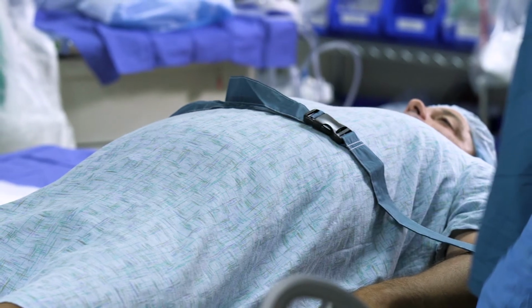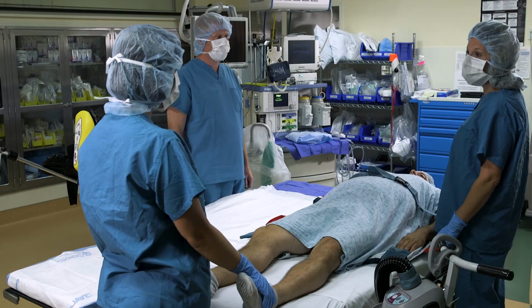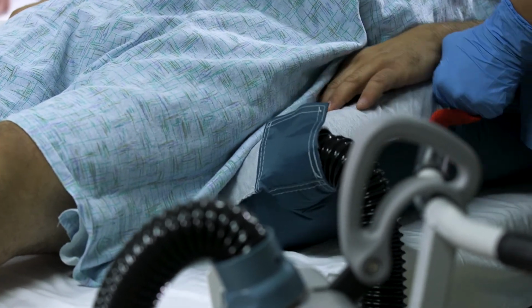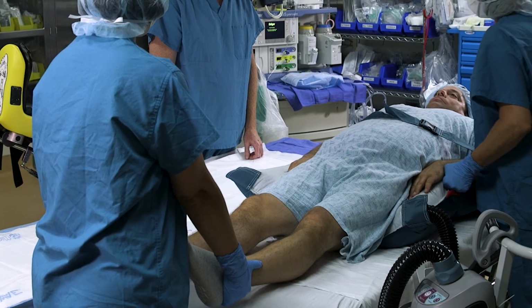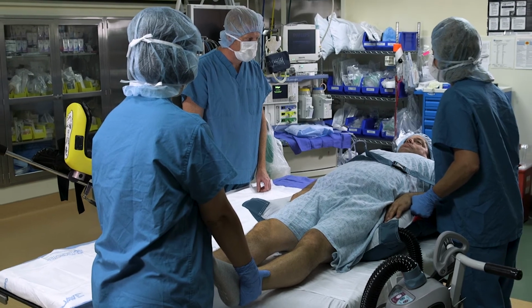attached. The caregiver should then assume the position of safety and give the signal to the caregiver at the foot end to inflate the half-mat by pressing the air supply button appropriate to the half-mat's width. The caregiver at the foot end will cradle the patient's ankles and feet as the caregiver located next to the patient begins pushing the half-mat at a slight angle onto the receiving surface.